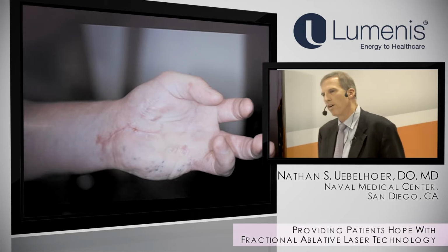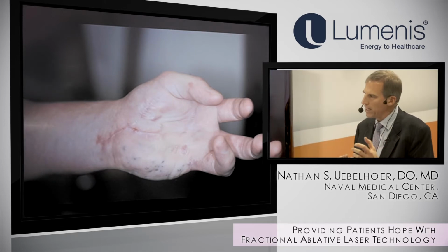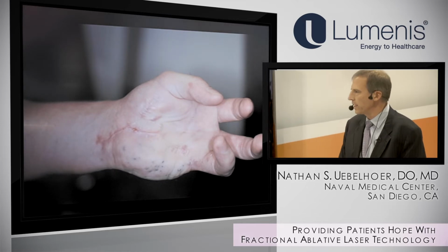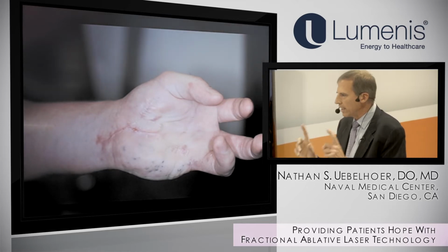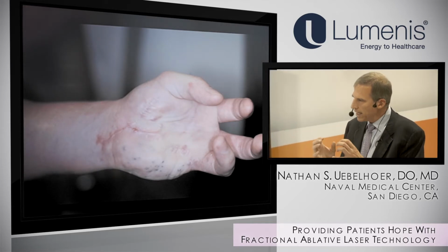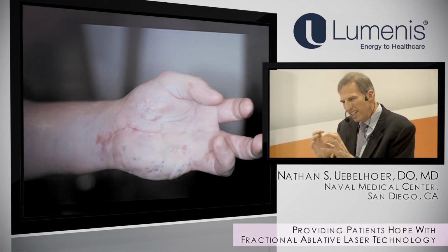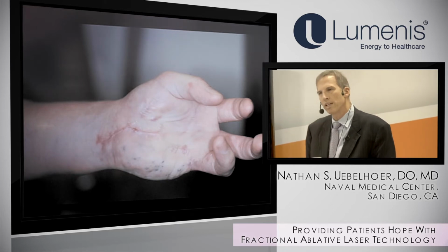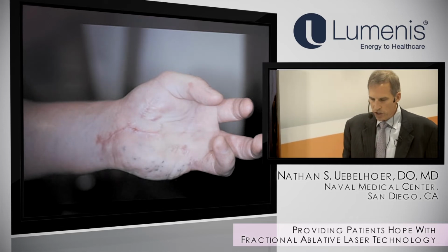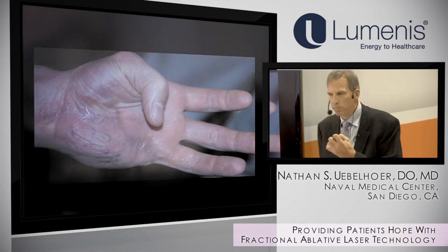And that's turned out to be one of our signs for where to treat. We look for where there's blanching, where there's the most tension in the scar. And in this case, you can see straight up through his palm, we treated that whole area with, again, a single pass, very low density, but very high energy. Not as when you think about doing full face resurfacing, where we're putting pulse next to pulse next to pulse. There's a little bit of gap in between pulses. We're trying as hard as we can not to get any overlap of these pulses. And sure enough, after 2 treatments, he was able to bring his thumb across his hand, able to move his fingers better.